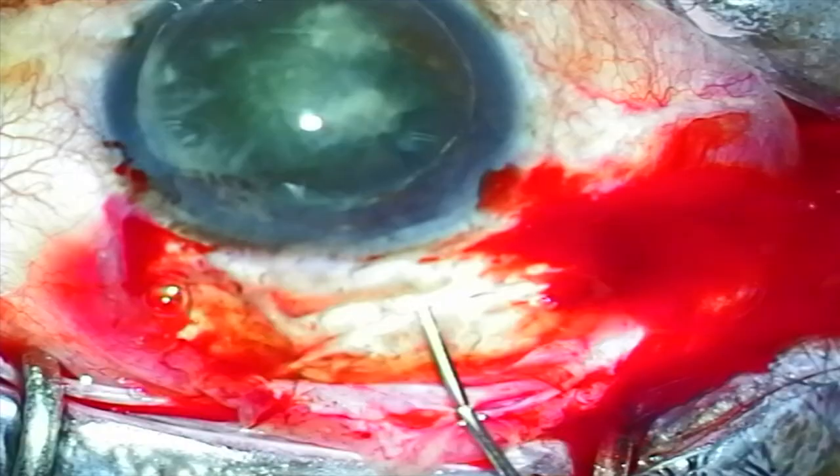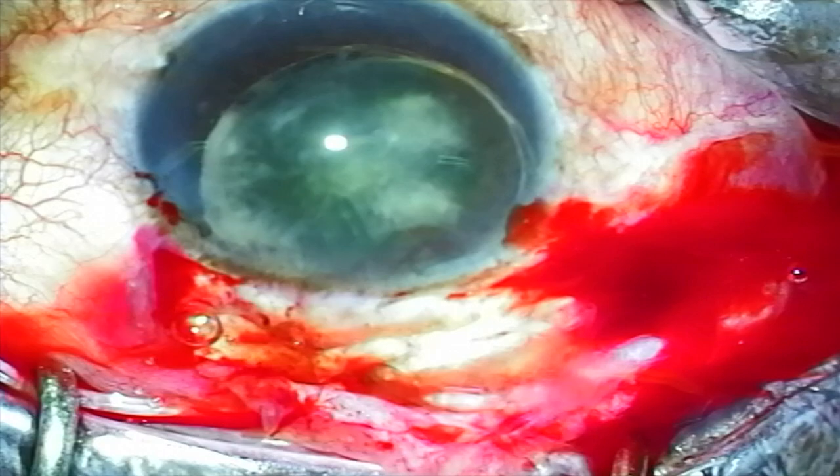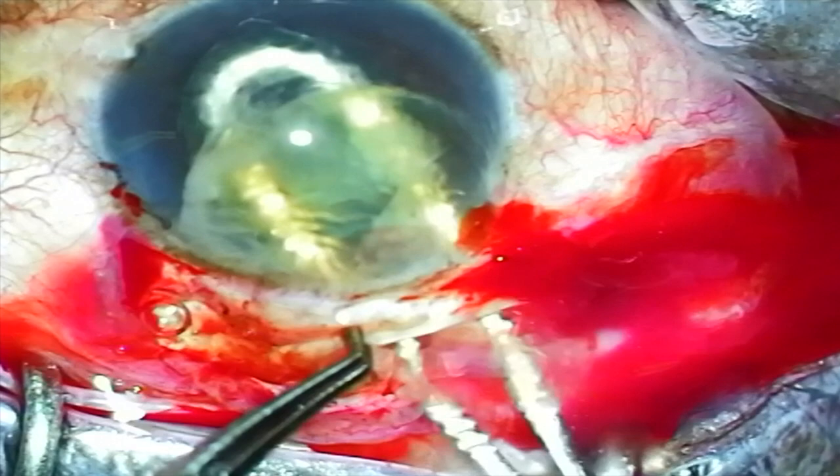Once the lens has been prolapsed into the anterior chamber, I use BSS on a 27 gauge cannula to bring the lens into the scleral tunnel. A lens loop is then used to remove the lens from the eye.